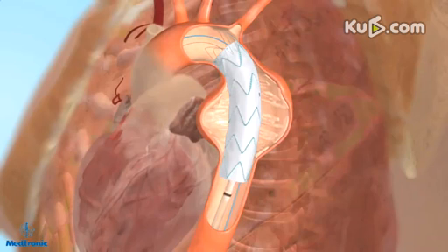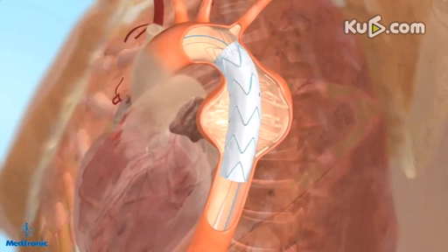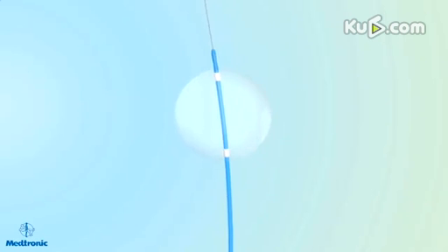Gently remove the delivery system using fluoroscopy to ensure that the stent graft does not move during withdrawal. The Reliant StentGraft Balloon Catheter, packaged separately, may be used to remove wrinkles and folds from the graft material as needed and to model the stent graft to the vessel wall.